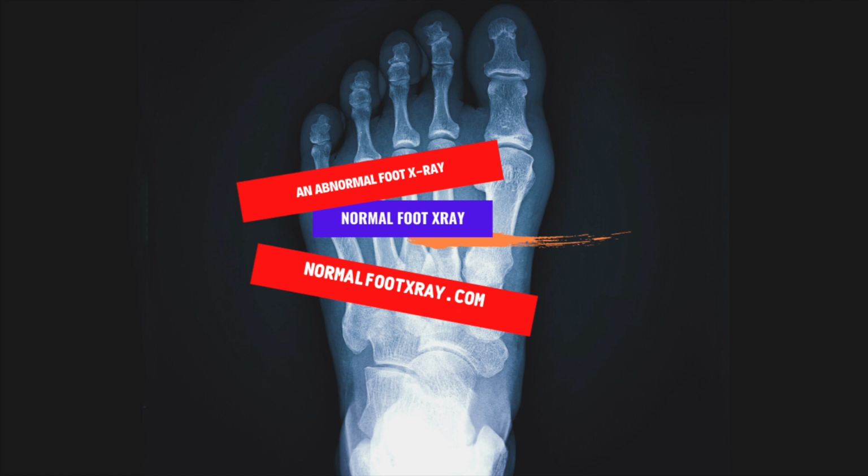The X-ray will also reveal tumors and cysts in the foot. It can also detect infections in the bones at a later stage. A foot X-ray is an important investigation in orthopedics.